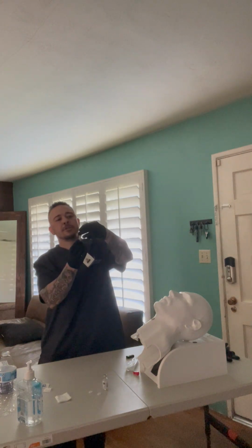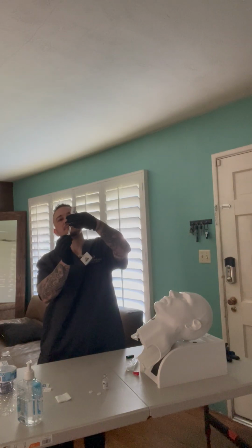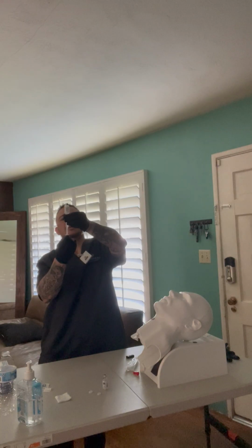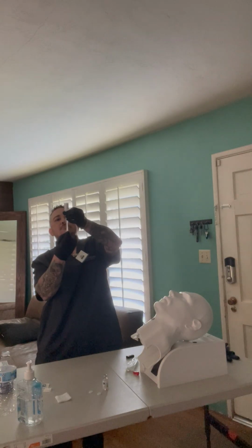I'm going to invert it like I inverted the regular. And after I invert that, I'm going to draw 8 units of the NPH. So that should give me 12.